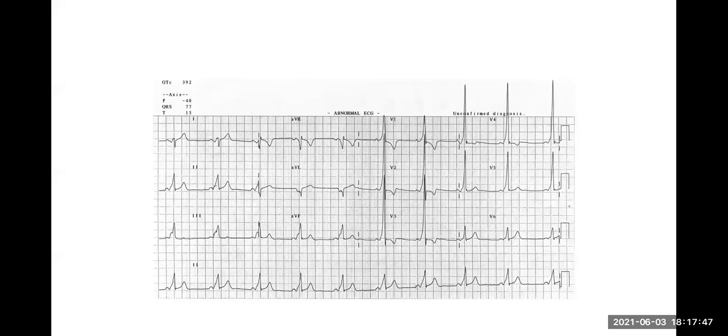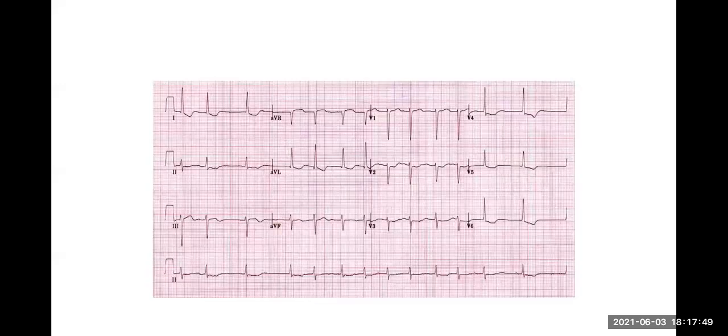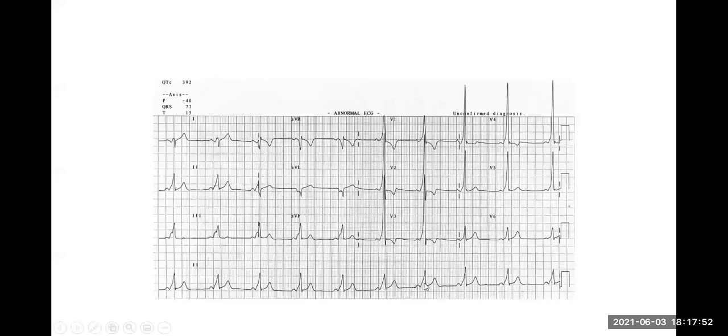Okay, this is not very important. So, Shali, there is no height to say tall T wave. If the T wave is bigger than half of the R wave, that is considered to be tall, in millimeters.